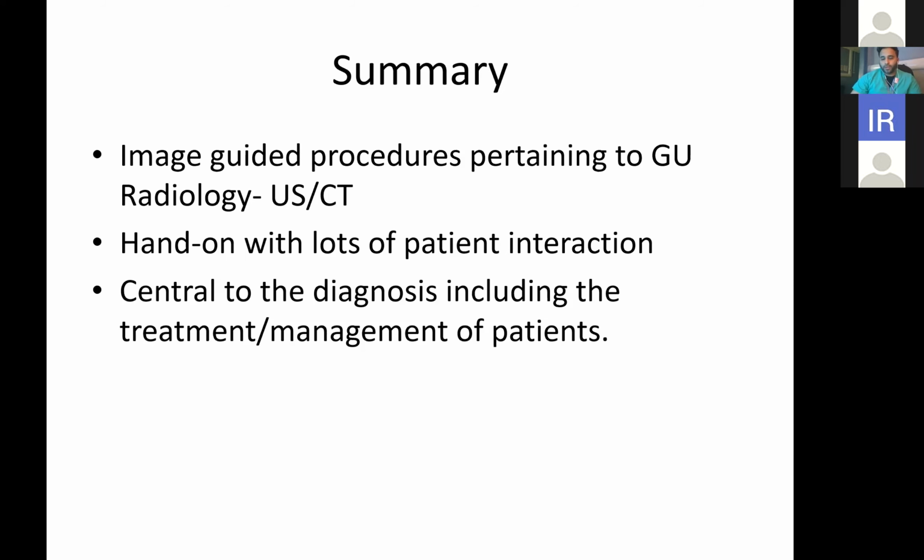So in summary, we've showcased several cases with three main themes, largely overarching ultrasound and CT, and a little bit of fluoroscopy-guided procedures. As you can see from the images, radiology isn't just about reporting CTs or MRI or doing ultrasound. Certainly, there's quite a lot of hands-on approach to patient interaction, and of course, we play a central role in the diagnosis of the patients who come through, be it acutely or through MDTs and things.